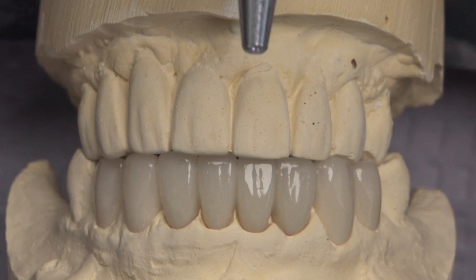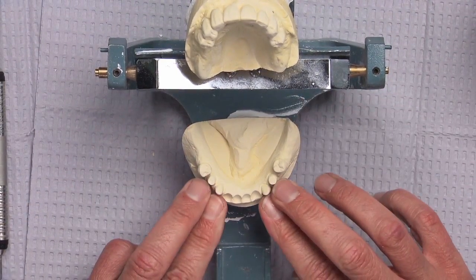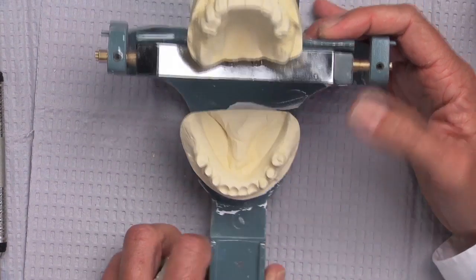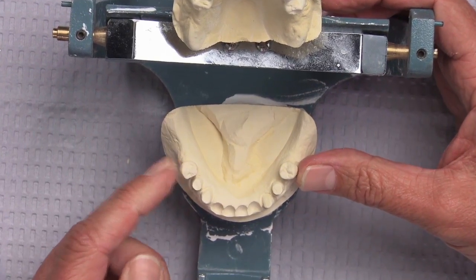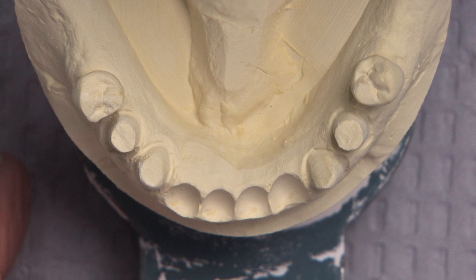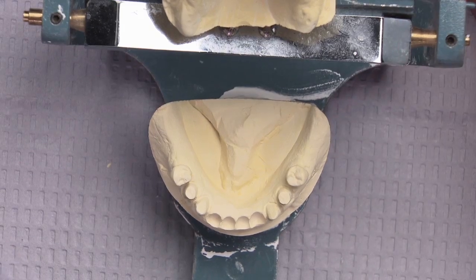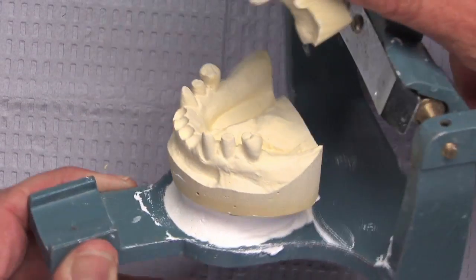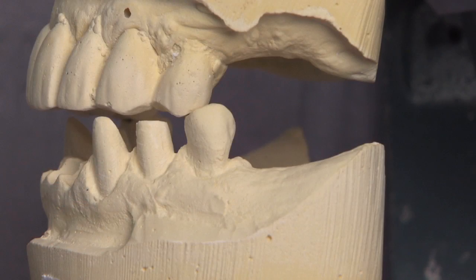With the bio temps in place, one of the things I like about what this dentist did — his plan is to prepare all these teeth; in fact he's preparing two teeth on each side. You can see the four extraction sites that will become the ovate pontic receptor sites. But you can see that these two teeth have remained unprepared. That's really smart in a case like this — if you don't do a lot of full mouth or full arch cases throughout the year, what this doctor has allowed for himself is a centric stop.